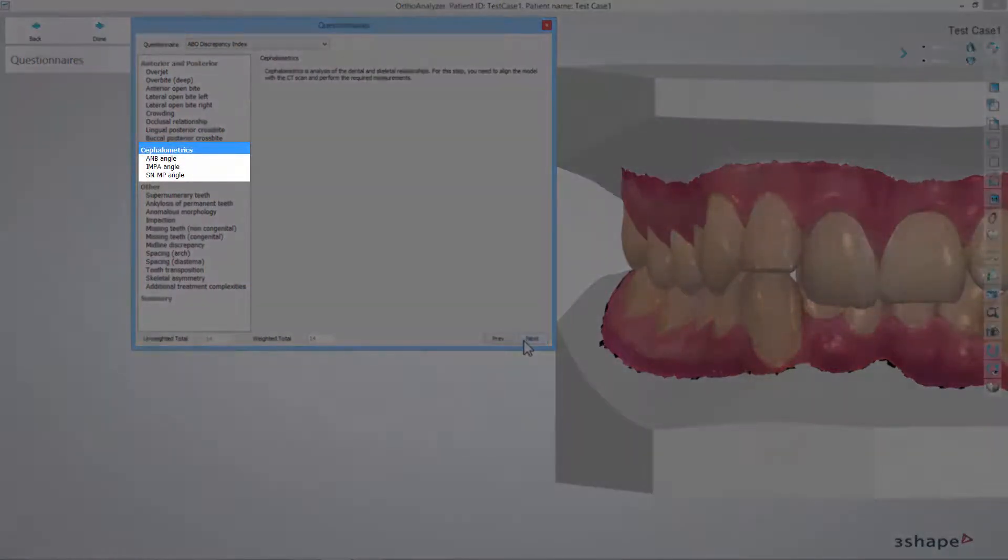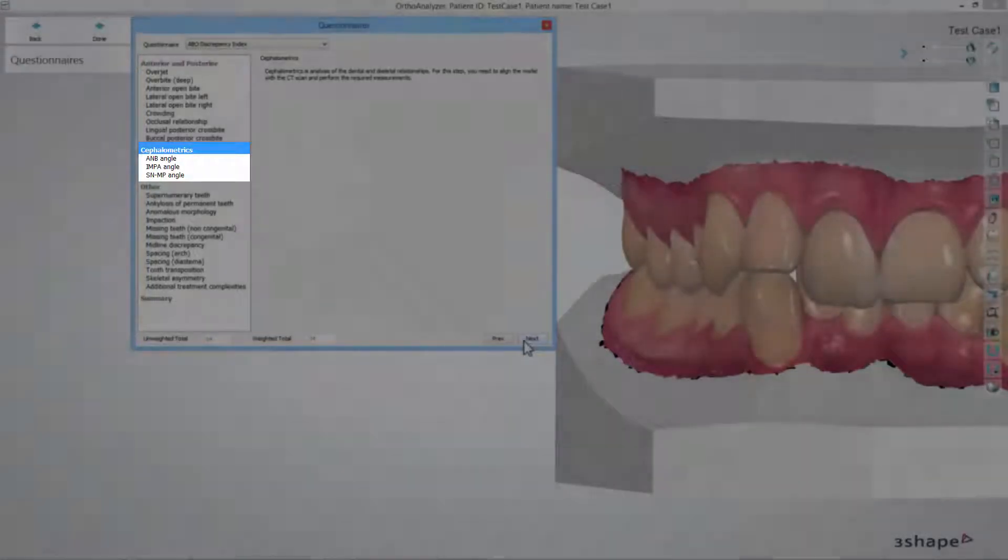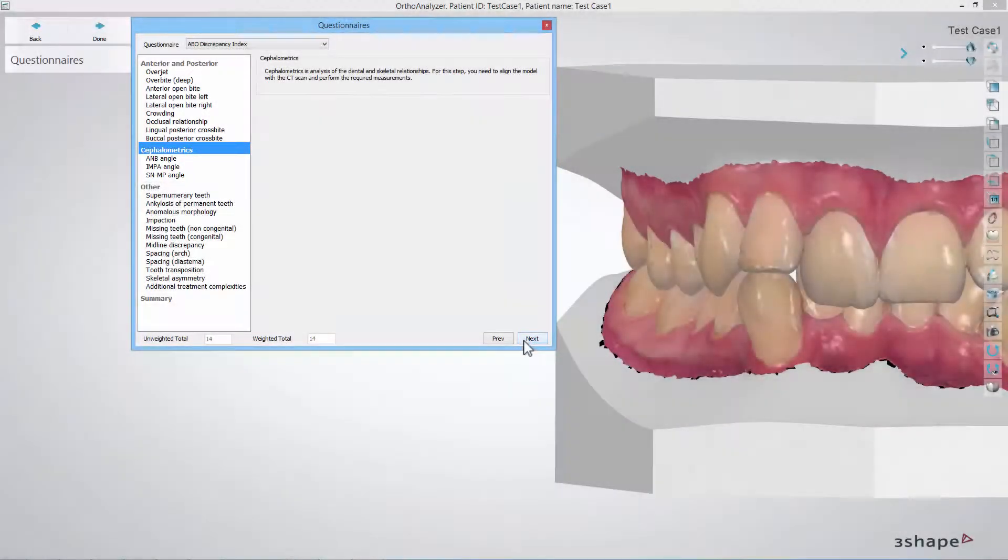The cephalometric section should be done outside OrthoAnalyzer. You could either use another software or perform it manually and then fill in the score accordingly.